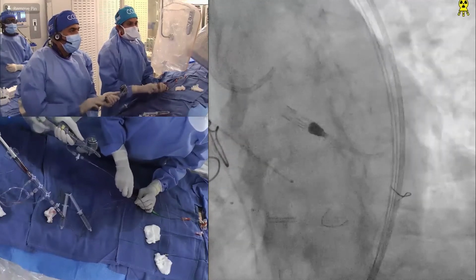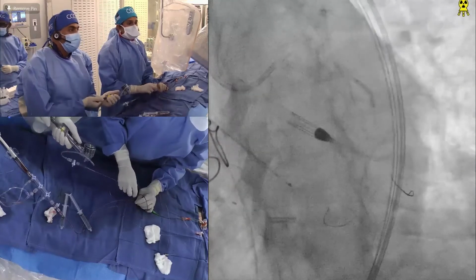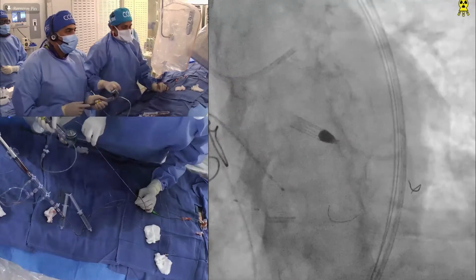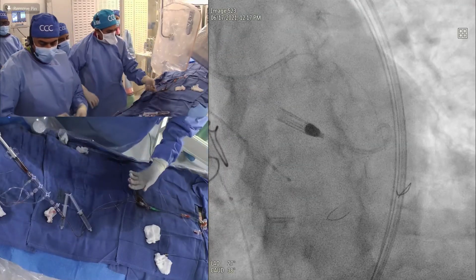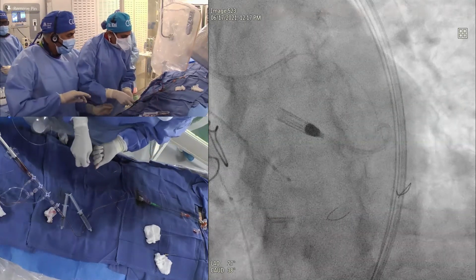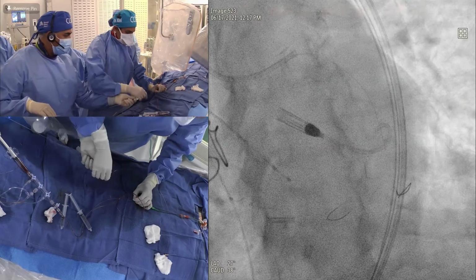Okay, go up there. My question is, if you direct back your wire into the main distal circumflex, I tried initially and it did not go. I had to maybe change the wire. Got it? Okay, let's start. Let me try now. Get the Godzilla ready. You can do it on both wires still here. Yeah.